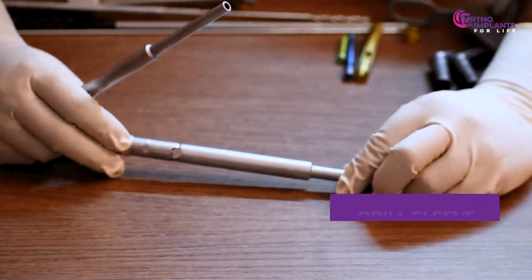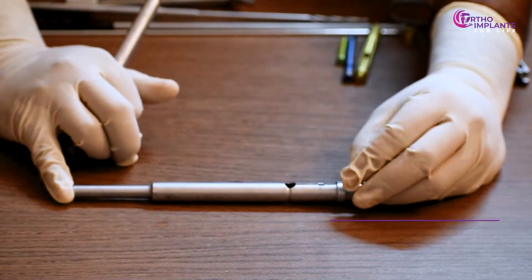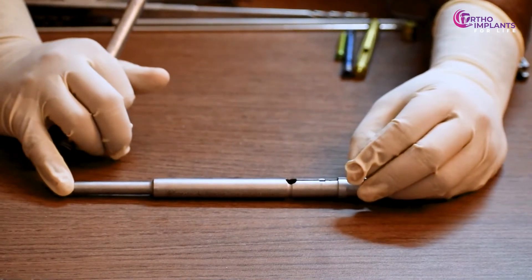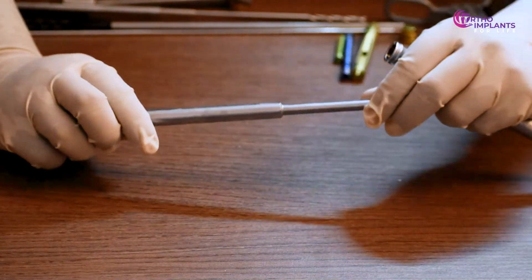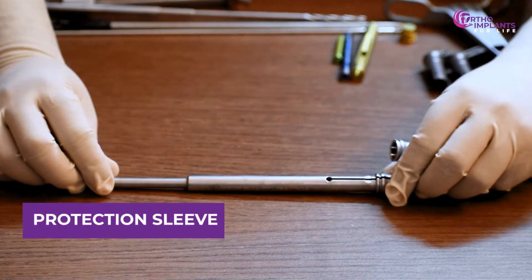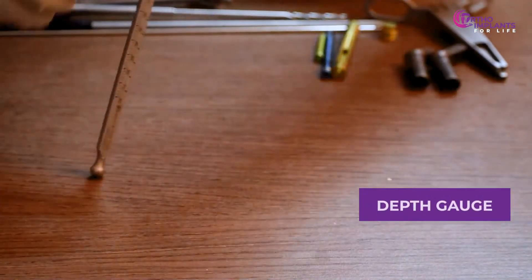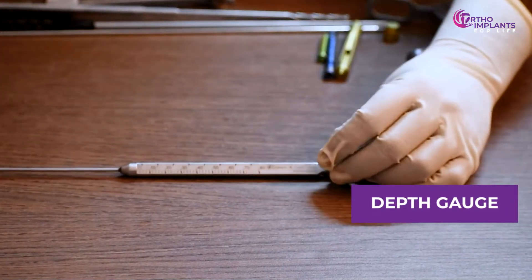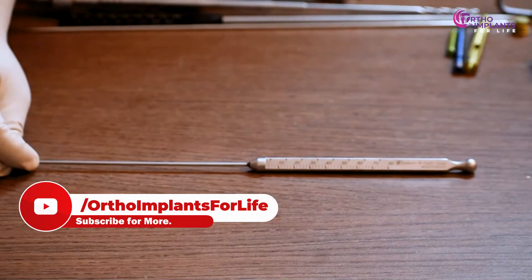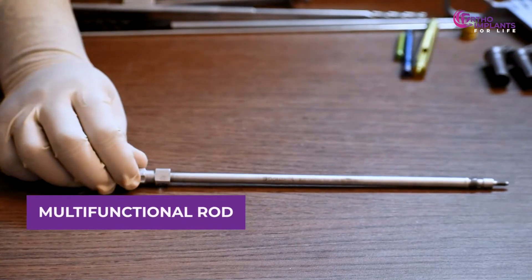This is the 4.3 millimeters drill sleeve and protection sleeve. This is the depth gauge. And lastly, the multifunctional rod.